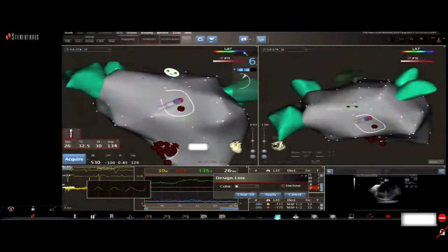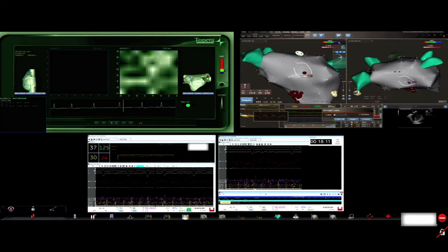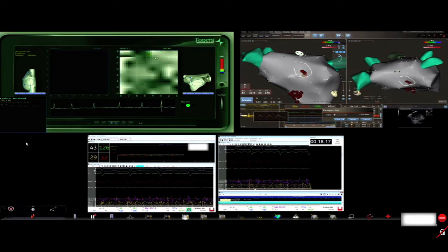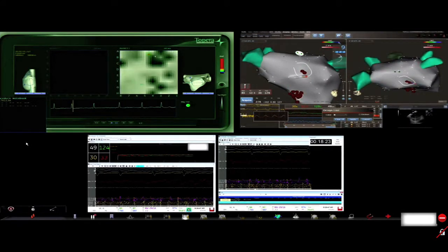If you want to go back and look at the map for this one, it's not at all clear to me how you identify these areas of rotation. I'm trying my best to blur my eyes and see rotation. Are there any tools that help you identify this more automatically?